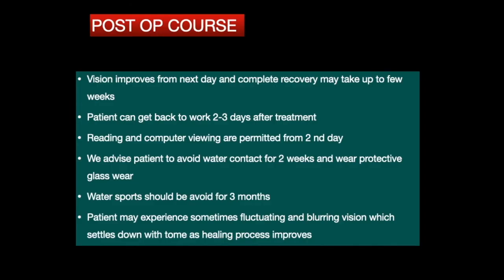We look at the post-op course in patients after LASIK. Vision improves the next day, and the complete recovery may take a few more weeks. Patient may get back to their work in 2 to 3 days after treatment. Reading and computer viewing is permitted from the second day itself.